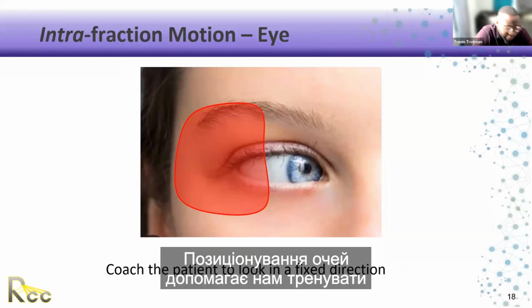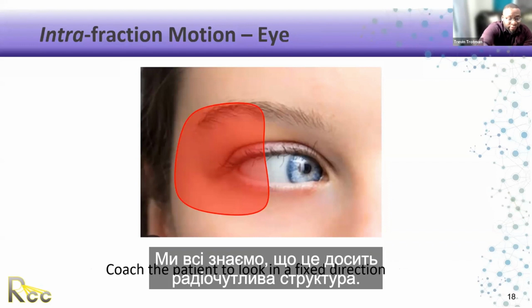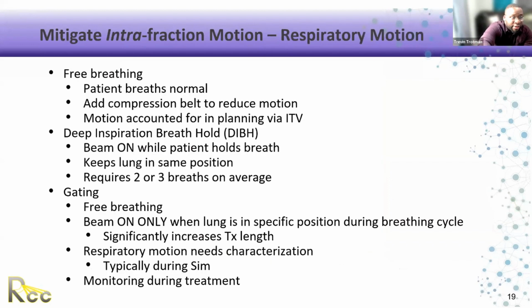The eye positioning is good for us to coach the patient to look in a fixed direction, and that's to help with the movement of the eye. We all know it's a pretty radio sensitive structure.